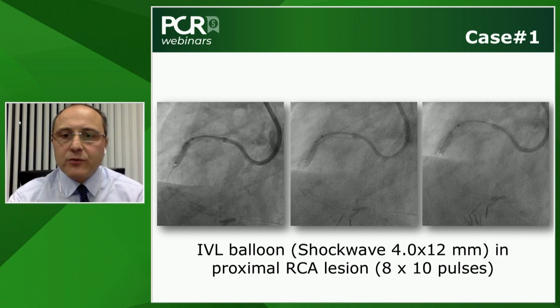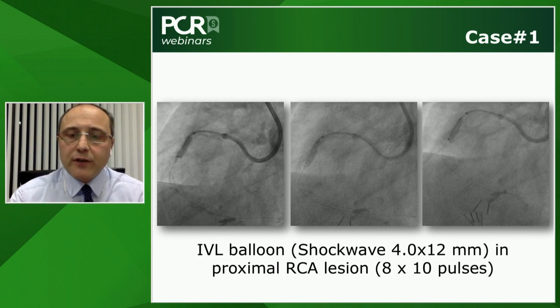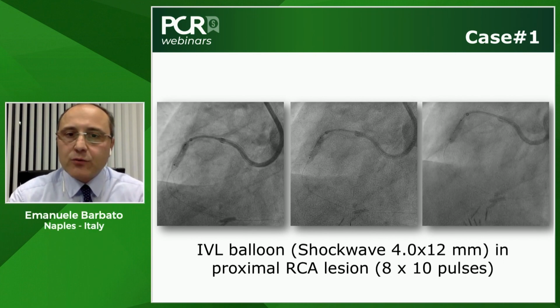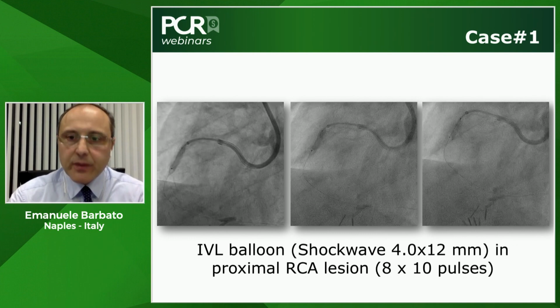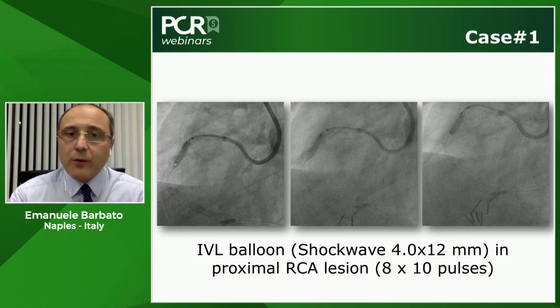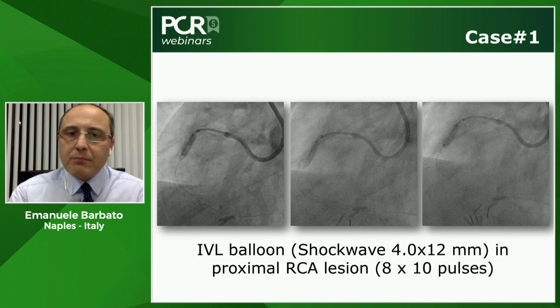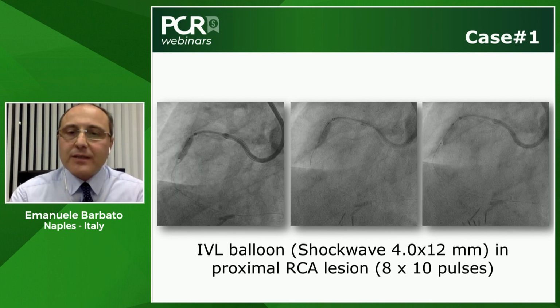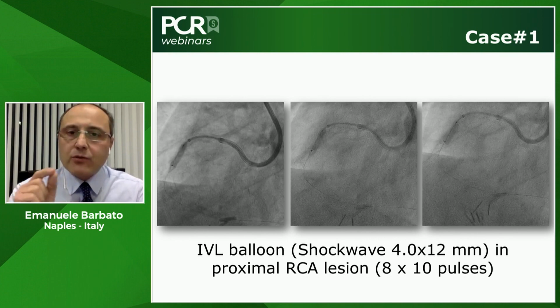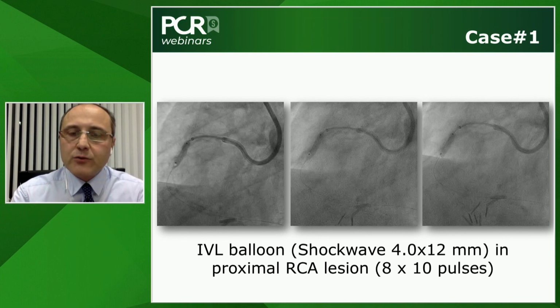Michael, if you allow me to interfere a little bit, up to what you have shown so far, I have two questions for you. The first one relates to the mother-in-child catheter. I understand perfectly the reasoning behind having a very supportive setup in this particular lesion. Is there any concern in choosing the size of the guide liner or Guidezilla or whatever, as it comes to the size of the intravascular lithotripsy balloon? That's the first question to you.